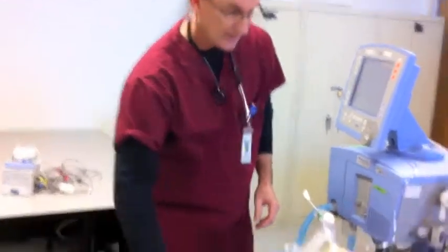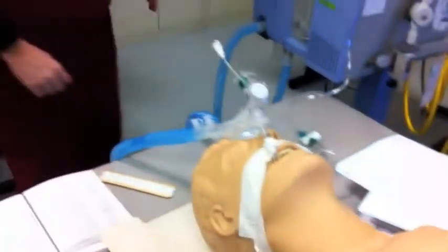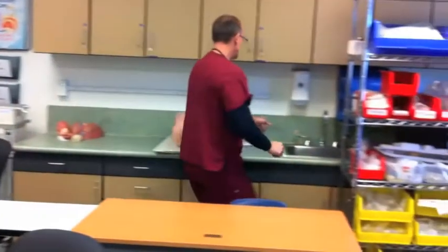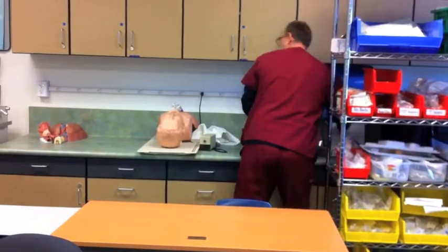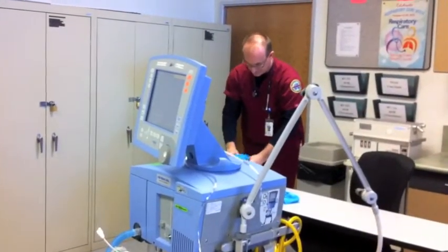Next, he's going to gather equipment. He's going to obtain a cuff pressure manometer, suction catheters if necessary, and gloves.